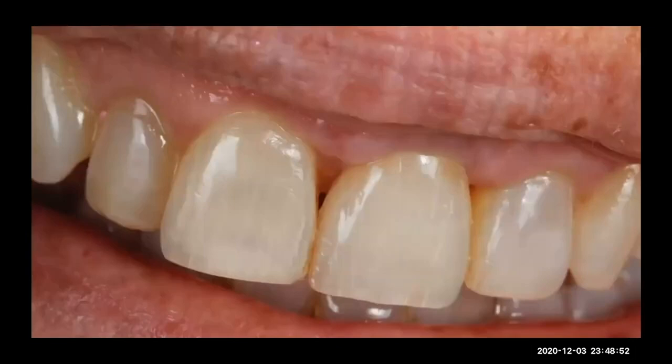So you can see another view of the crown. It's not perfect, but it's a difficult case. It's a tough, tough case. I can guarantee that if we build this crown, we need to do it like 2 or 3 times to get close to the original color.